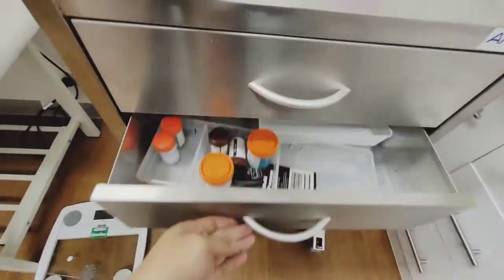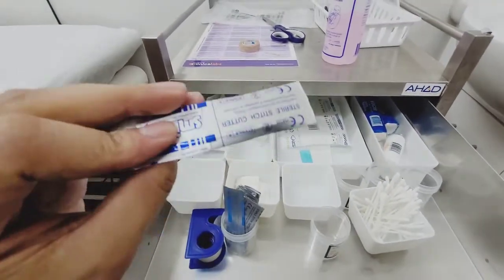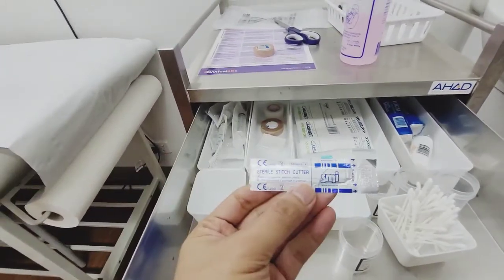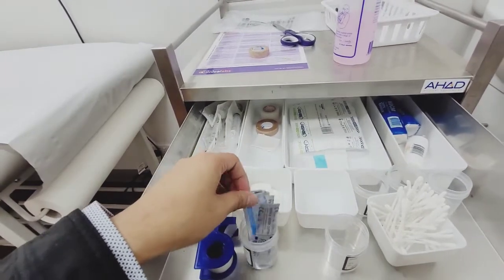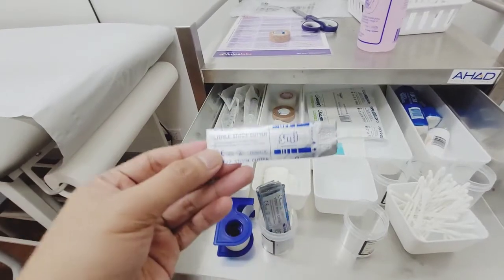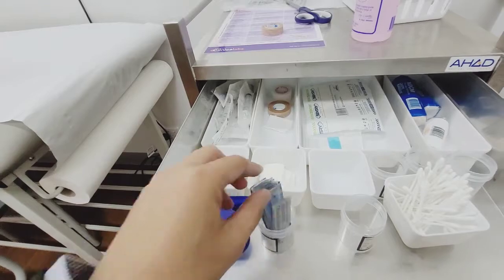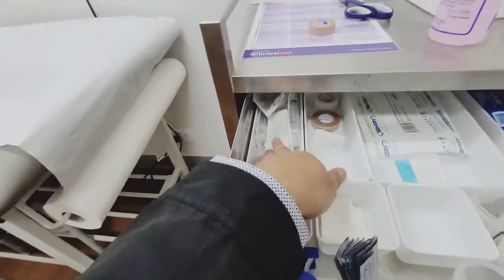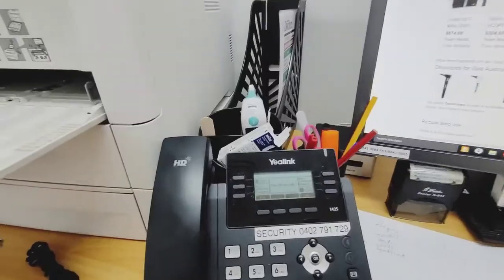Okay, and then we have this. This is a sterile cutter, or a small knife, especially for if you have boils or blisters or infection, or a wound that's full of pus that needs to be drained, then I use this one, the small knife. And then we have syringes, bandages, and cotton buds.